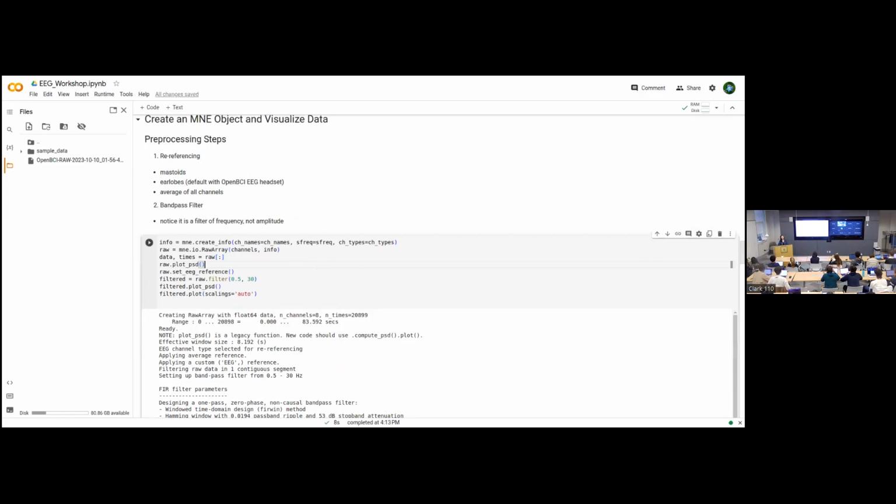If you remember from the EMG workshop, we placed our ground on the elbow, right? That serves as a ground to correct for potential, and it serves the same purpose in EEG. For re-referencing in EEG, there are different sets of references that we use. A very commonly used one is the mastoids, the bones right behind your ears. Because they are relatively close to the other electrodes and should not be expected to carry any EEG data, we use them as a referencing point.